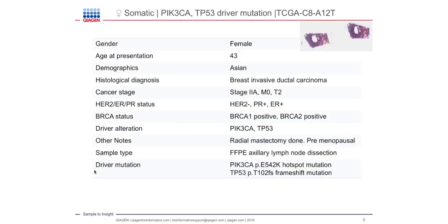So during the presentation, I will start with the first case, and during the first case we will take a look at the software itself. And then for the remaining cases, we will only take some snapshots, given that we wanted to present to you 5 different cases.